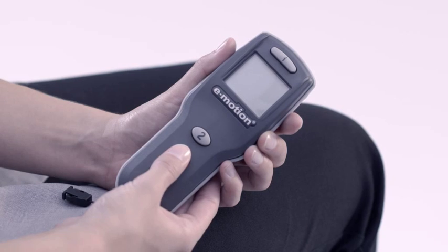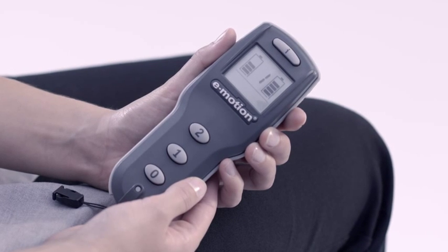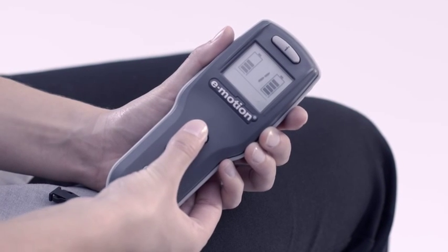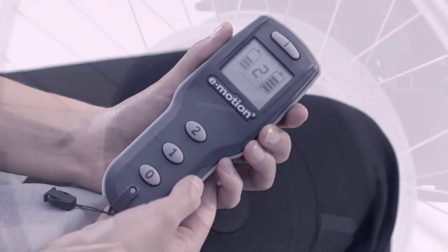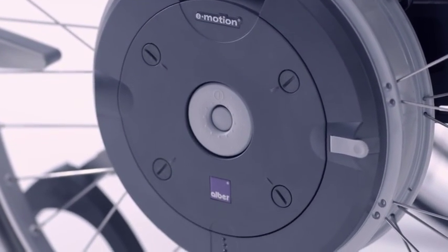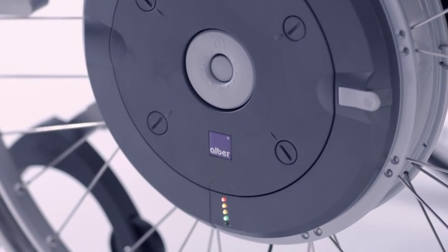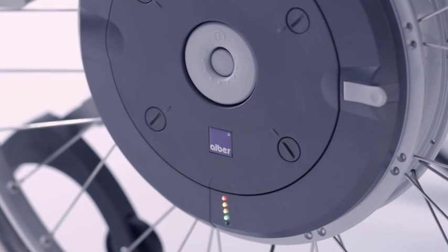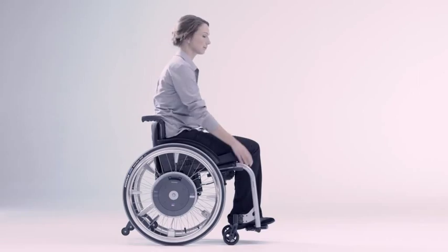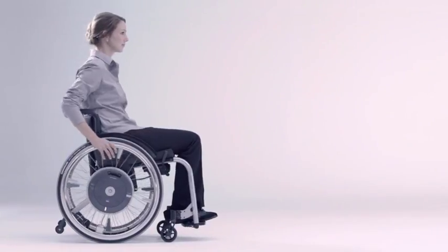E-Motion is switched on and off using the remote control. Two selectable power levels can raise or lower the thrust of the motor. E-Motion can optionally also be switched on and off on the wheel if required. The battery monitor reliably informs you about the current battery status. The power is increased via the push rim as required.